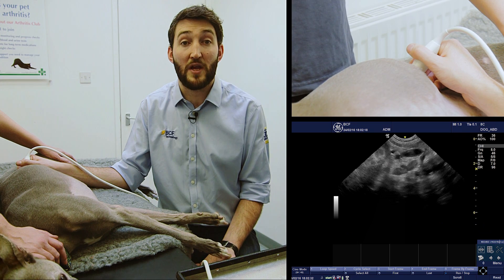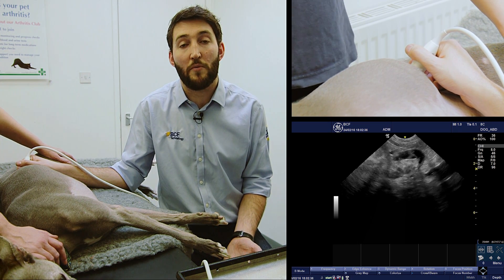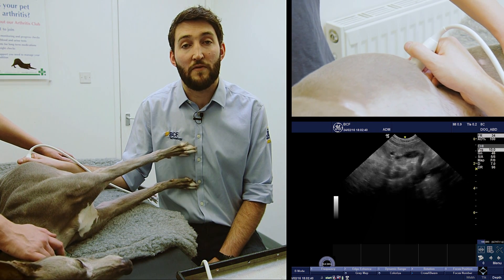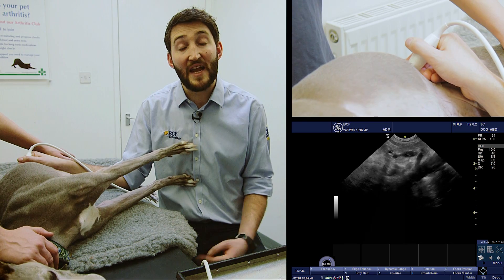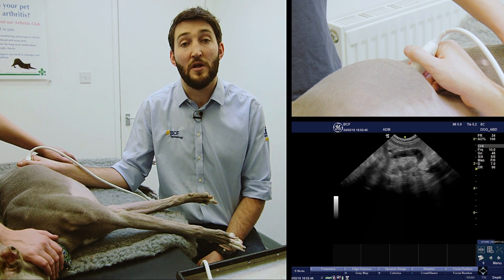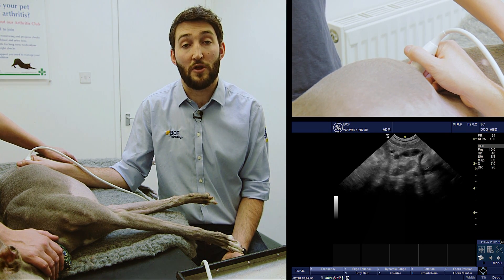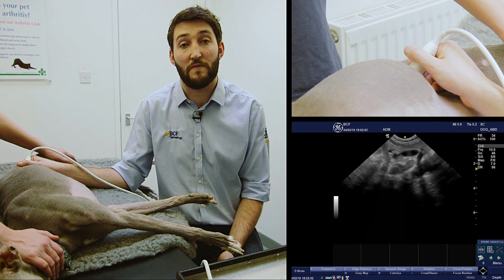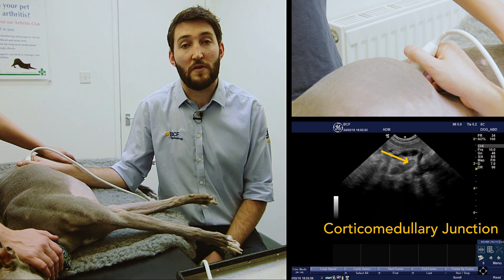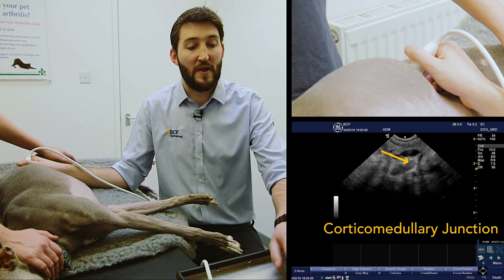You may also be able to make out what appears to be another vessel crossing the middle of the gland — the phrenico-abdominal vein as it crosses the body of the adrenal gland on the ventral border. Where you do see it, it's another indicator you're looking in the right place. Depending on equipment quality and the animal's condition, you may also be able to make out a differentiation between the cortex and the medulla of the adrenal gland.